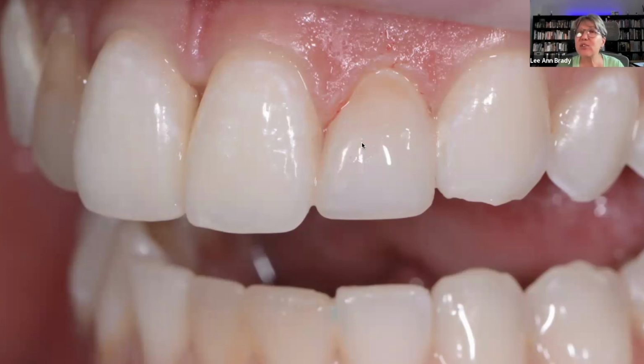And I do need to post-op her. So all of these kinds of composites, this patient is already scheduled back with me to come back in about 72 hours so that I can evaluate the final aesthetics, take some new photographs, and we can make adjustments if we need to at that point. I could just remove one layer, the enamel layer, or I could just remove the lingual layer if it's not opaque enough, and I could still bond to the other composite because I still have monomer. Okay. So that's really that thought process.